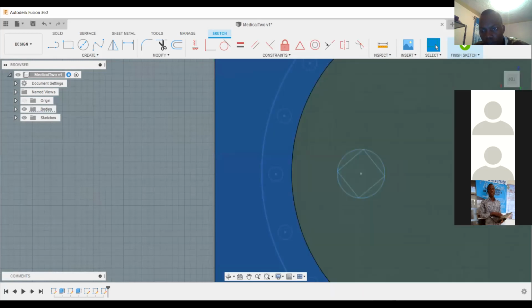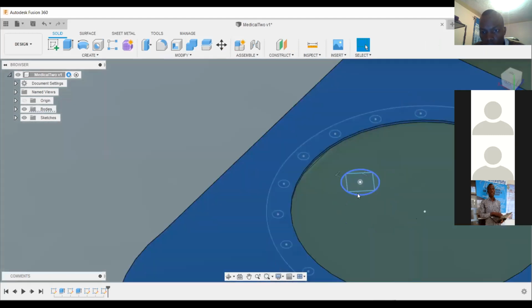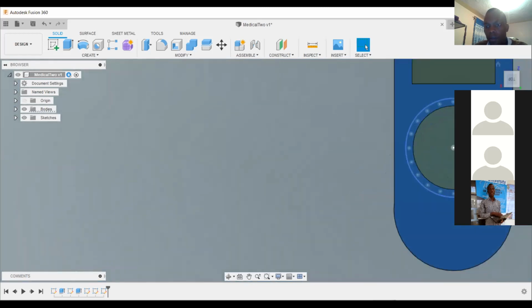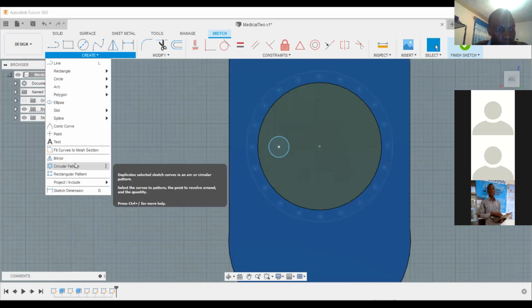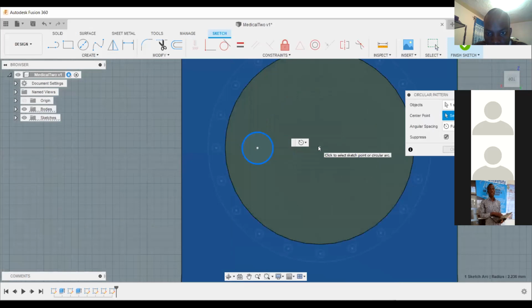Okay, guys, can you see this? Let me delete these ones. I don't know why they have this. There's something. Let me draw it again. Let me just start with a simple one, then create a circular pattern. Then you click this, then select center, which is the center of the circle.